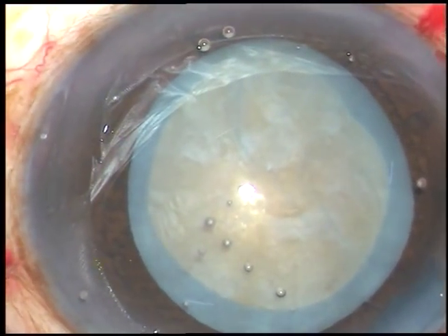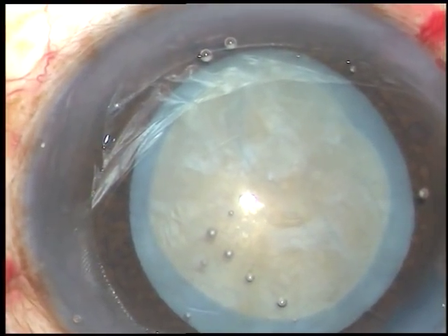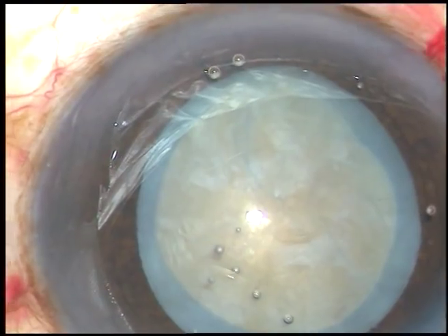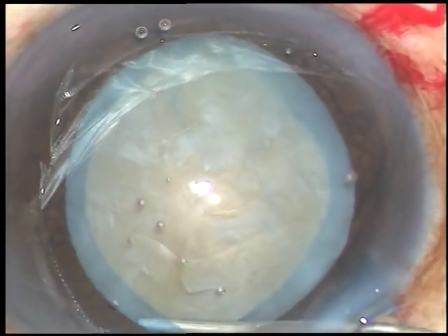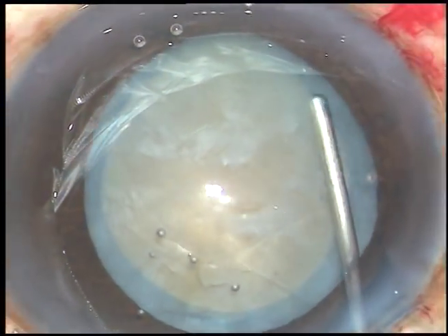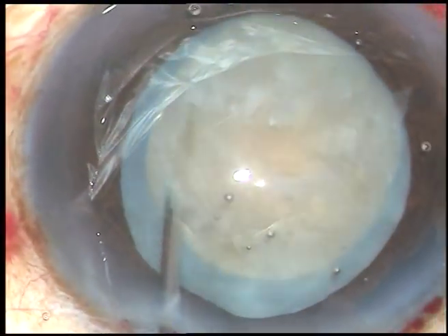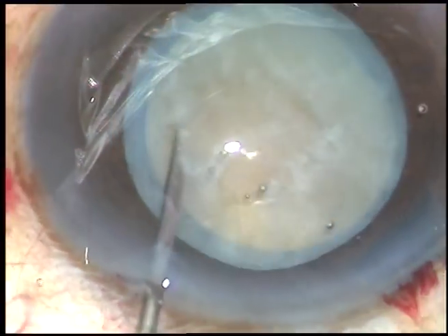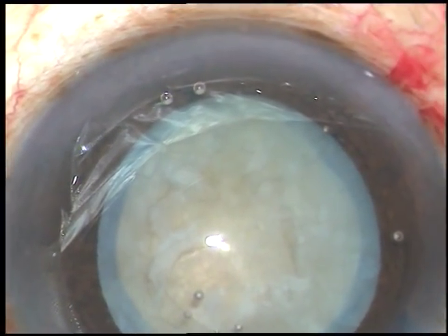And now, hydrodissection is done. The cataract is hard, so only a little bit of fluid is injected just under the anterior capsular rim — here also. At two points, small amounts of BSS have been injected. The nucleus is now free from the capsule and it is rotating.